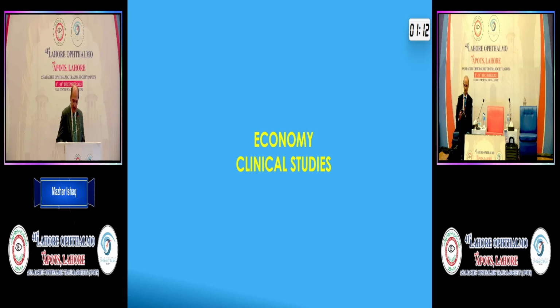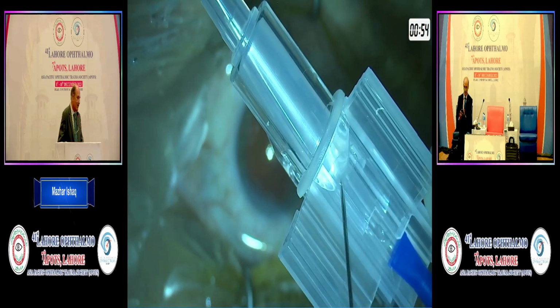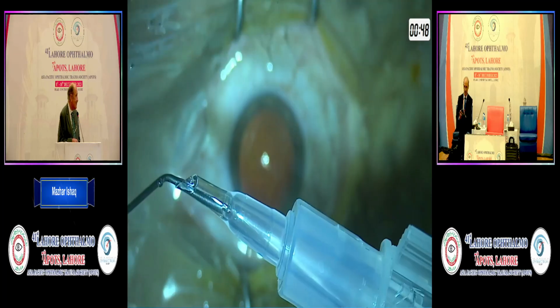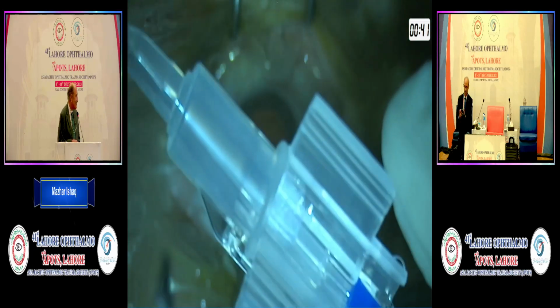I started using these lenses about 3 months ago, and we have done about 30, 40 cases. I'm not showing the exact results because for most of the patients, only 1 or 2 eyes are done, and the complete study is not done. But I just wanted to show you what kind of problems you see with this lens. It looks like a very ordinary lens. But you have to put hot water in it, because it's quite a rigid lens. So that is a problem with this.